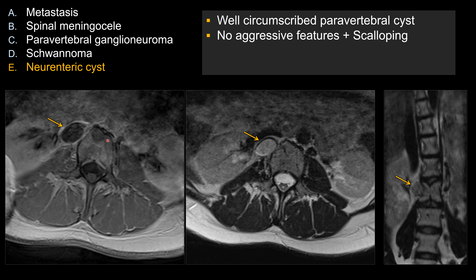You can see that there's no effect on the adjacent bone, so there's no osseous invasion, no abnormal enhancement on this post-contrast T1-weighted image. There is no mural edema. You may also appreciate that there's mild scalloping of the adjacent vertebral body, which tells us that this lesion has been there for a long, long time.